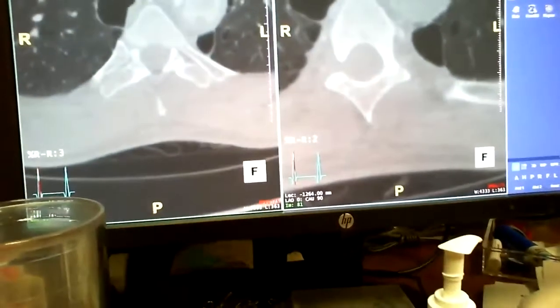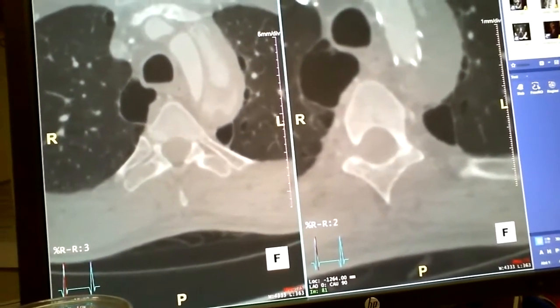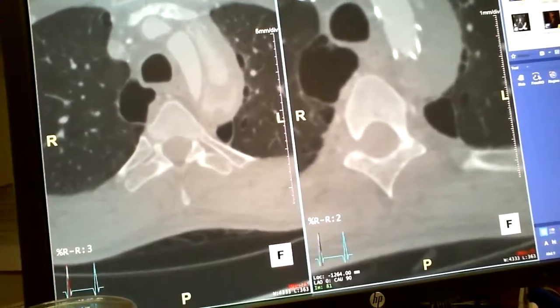That can compress the true lumen of the aorta and cause malperfusion, where there's poor circulation either to the limb or to the gut, in some cases to the spinal cord, causing ischemia, or even to the brain, causing malperfusion of the brain and an acute stroke. So let me give you an idea by showing you a CAT scan of a patient that's had treatment in the past. If I can hold my hand here and show you this CAT scan study.